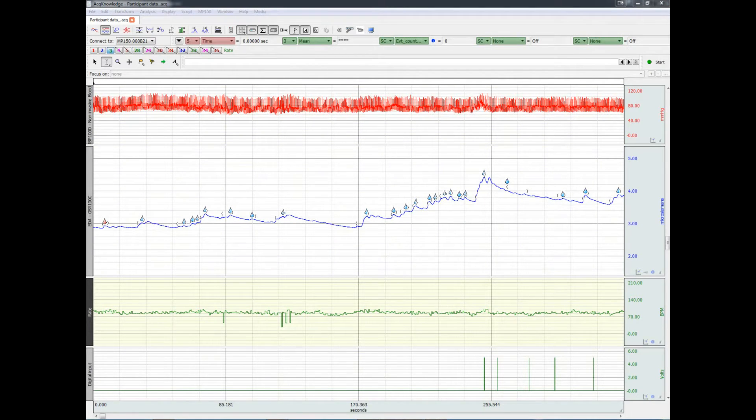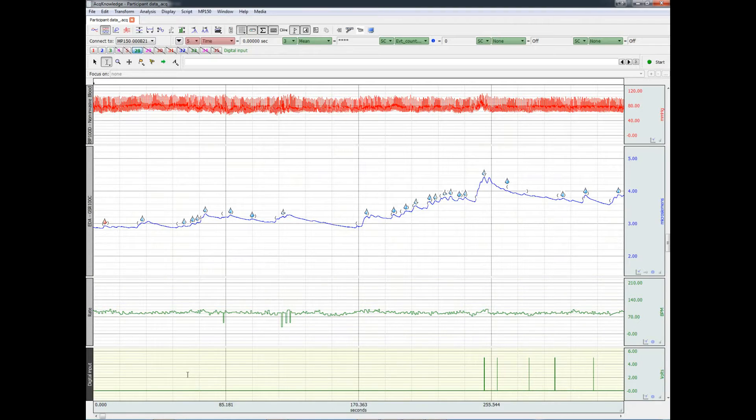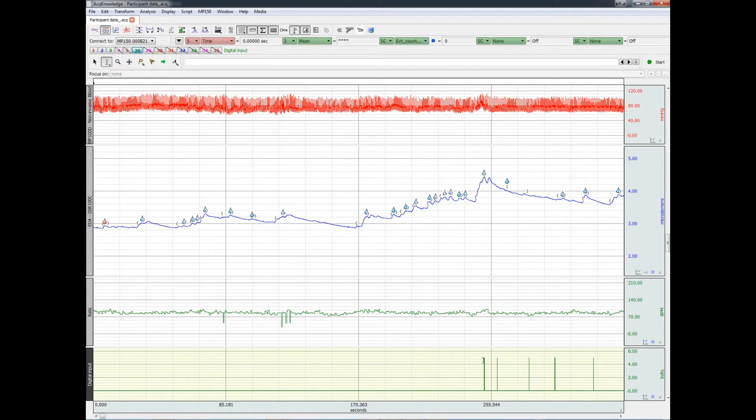A digital input channel has recorded the trigger from SMI that came over the parallel port at the beginning of the experiment. It's the one right here.